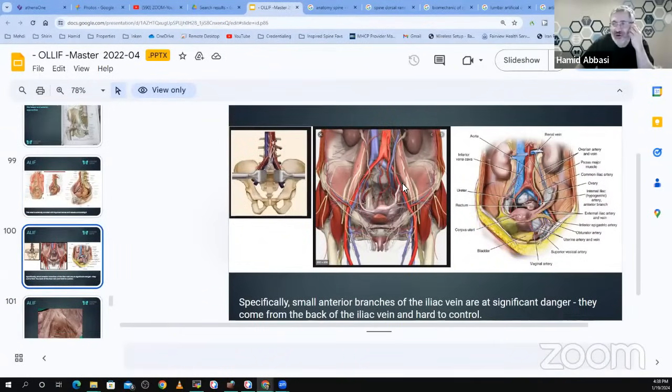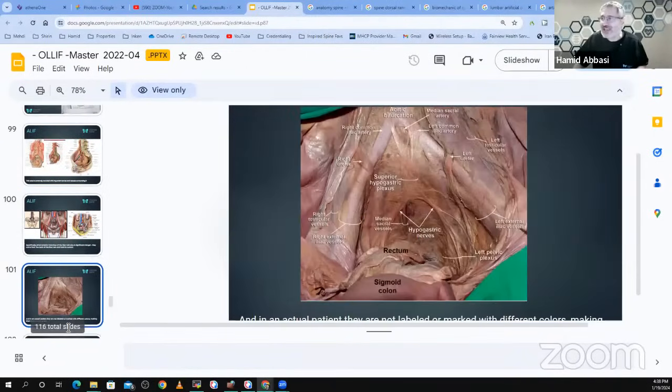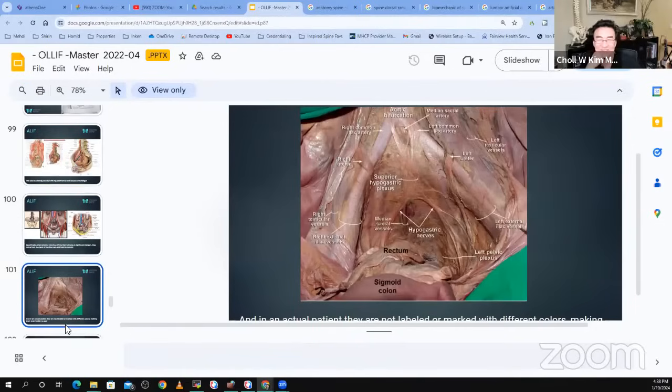And even though as surgeons we know how to go around this stuff, it gets even worse when you open it up. It's not like your veins are colored blue and the arteries are colored red and the nerves are yellow. It looked like this. Yeah, it doesn't even look like that. That's a pretty clear picture. Worse than that, because this is a cadaver. It's all clean, no blood. Everything is open. You go in a small place.